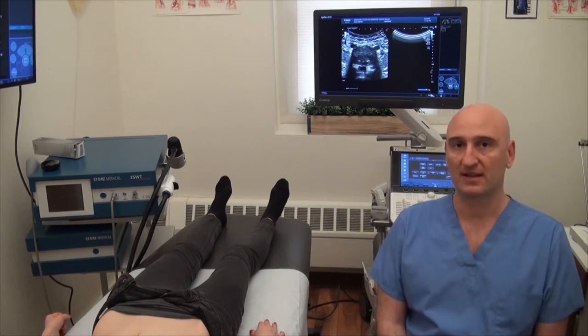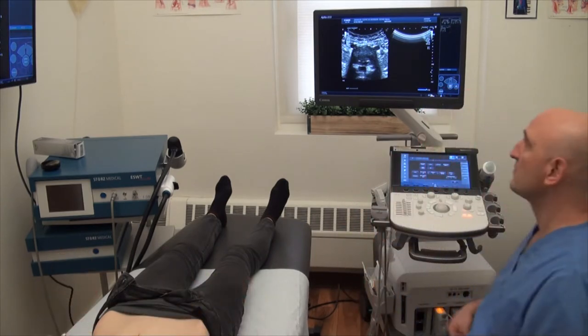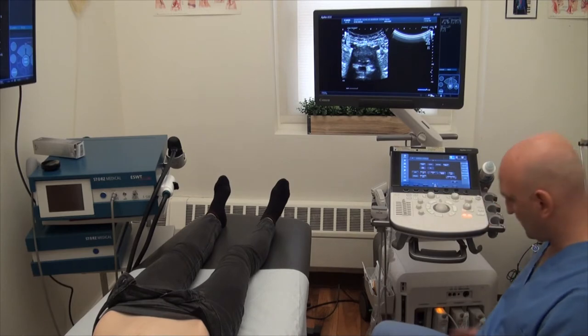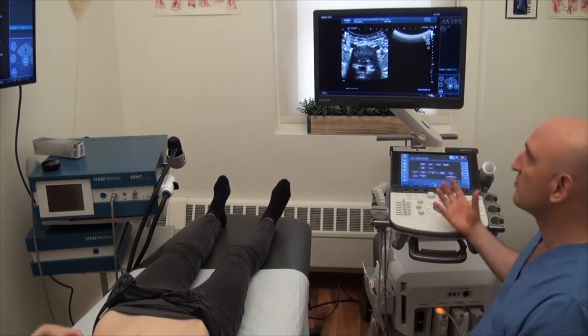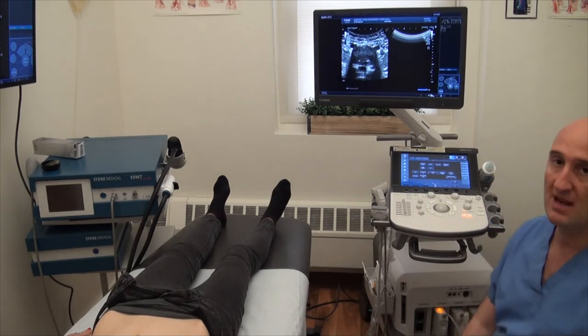Therefore this clinical method, especially today with this new machine which is humongous, has a lot of power, great hardware, and fantastic resolution — it has really become relevant.